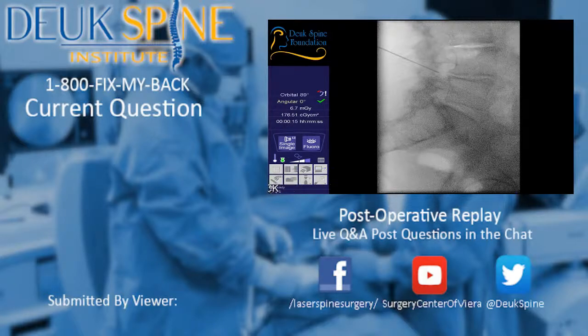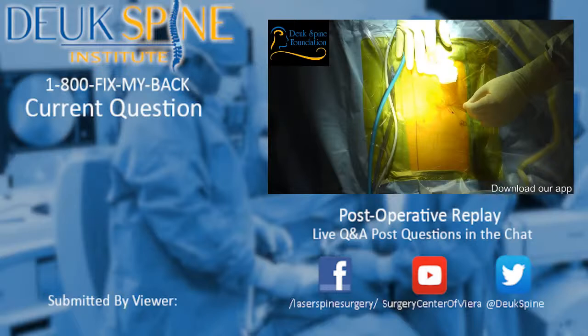This is Dr. Deukmedjian, just wrapping up our Deuk Laser Disc Repair, left side L3-4, L4-5. Why did this patient have surgery? They had herniated discs and a degenerated disc at L3-4, L4-5, with back pain and left leg pain called sciatica.